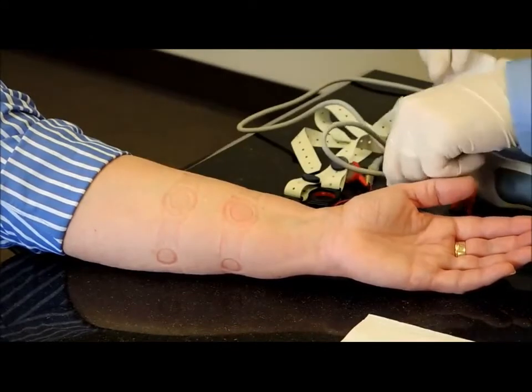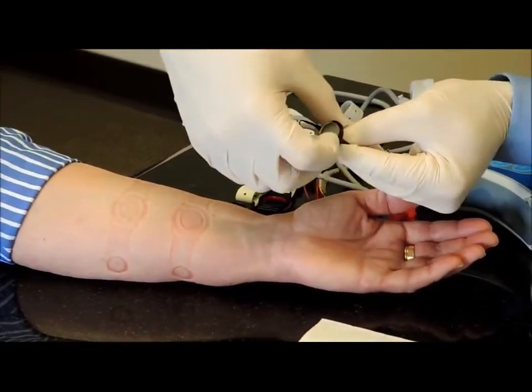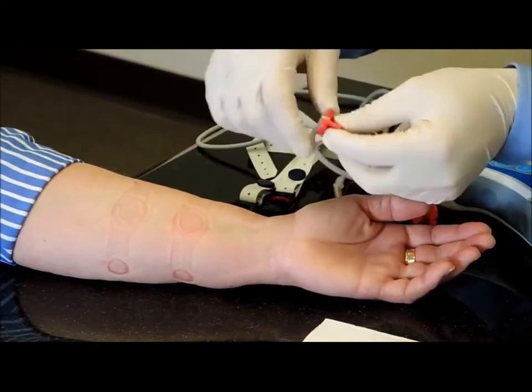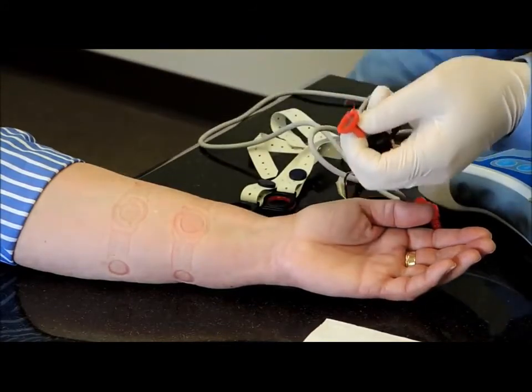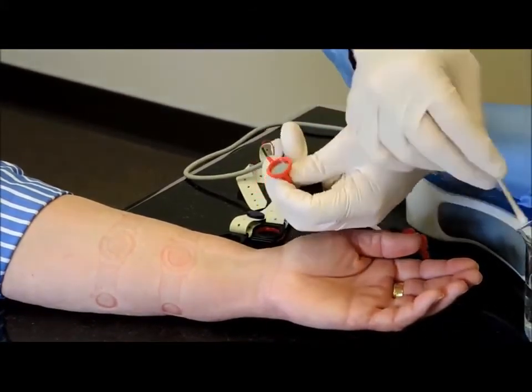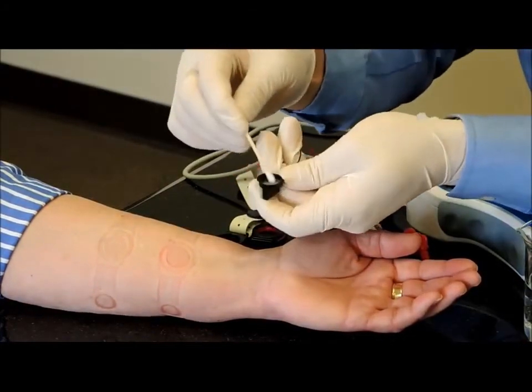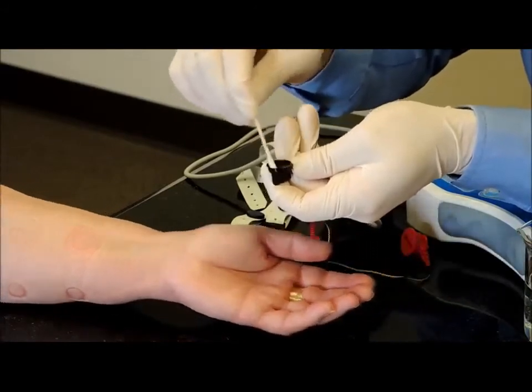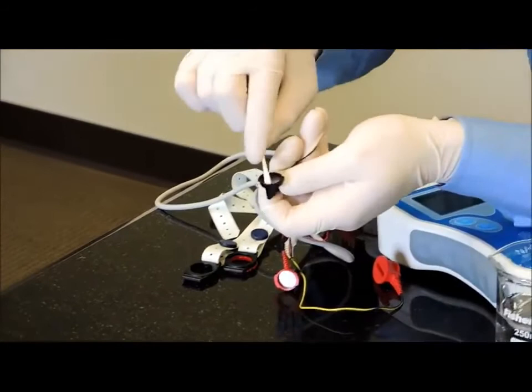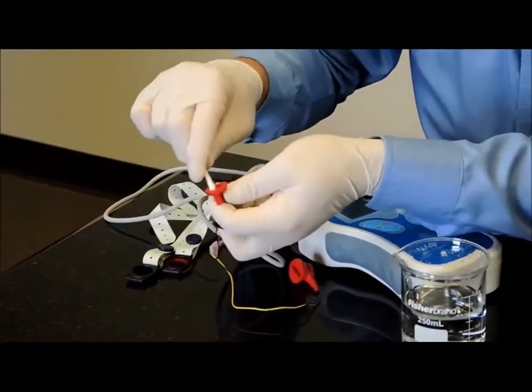That's normal. You'll also want to take out the discs from the electrodes. Just pop those out. And at this point, using a little cotton swab, we like to just wipe those with some water or some isopropyl alcohol just to clean off those. And then with a dry one, dry it off so it's ready for the next patient.